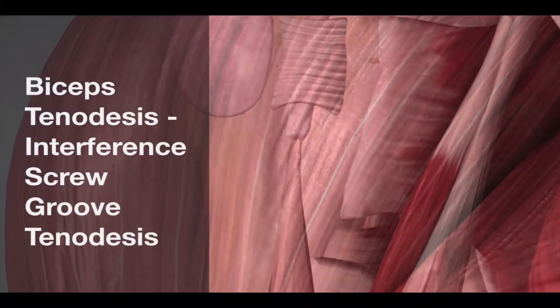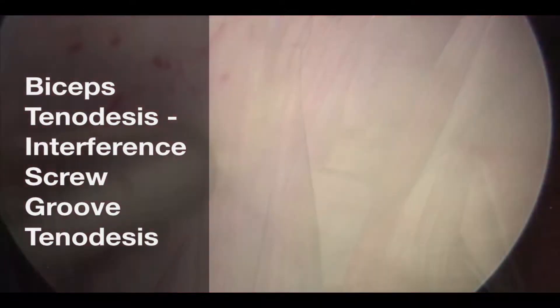Long-headed biceps tenodesis using an interference screw within the groove. This is the left shoulder.